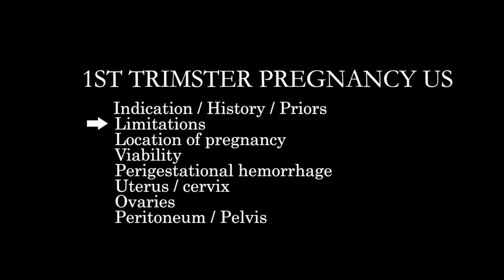Then we'll go through the study QAing, and just basically, like with all ultrasound studies, making sure to what extent are we seeing the fullness of the anatomy? Are we seeing it on grayscale, color? Do we have spectral Doppler as needed? And it's important to know, by the way, that if you are scanning real time, all transvaginal exams should be done with a chaperone, allowing the patient to insert the probe themselves. Be respectful of variations in patients' preferences as to whether they are amenable or will decline the exam. These sorts of things are really important in doing these exams.